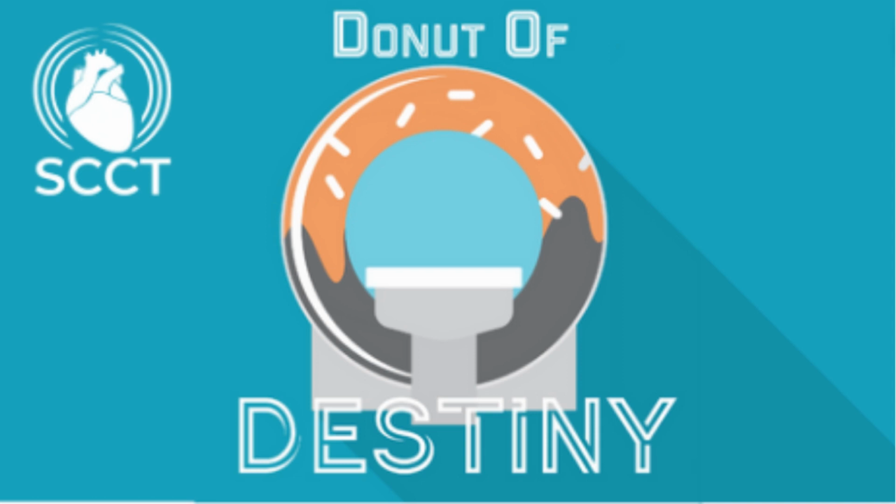Nidhi, ADVANCE is an acronym that stands for Assessing Diagnostic Value of Non-Invasive FFRCT in Coronary Artery Disease. The intent of forming the ADVANCE registry was to determine the real-world impact of FFRCT.